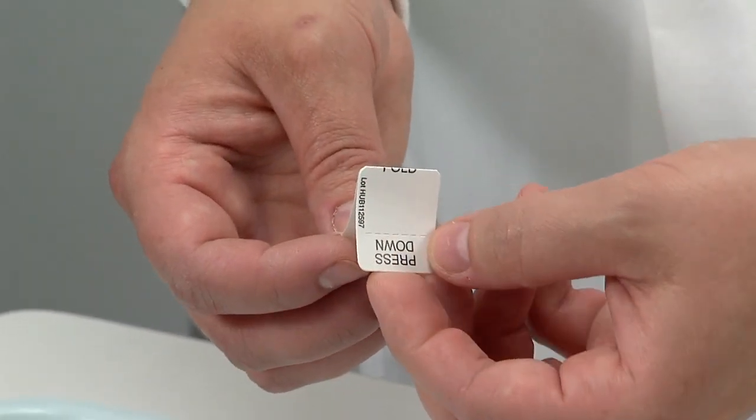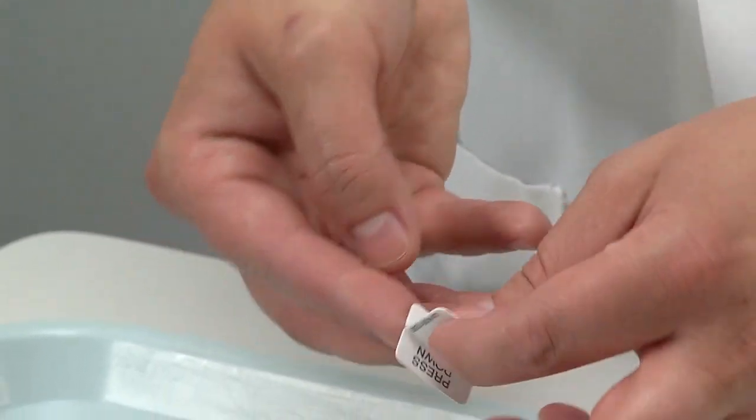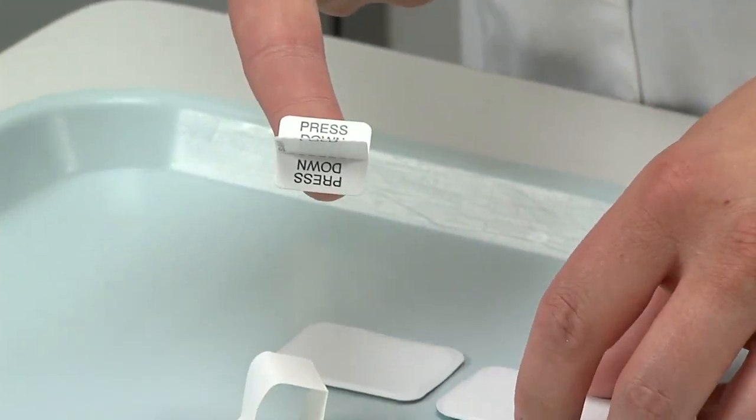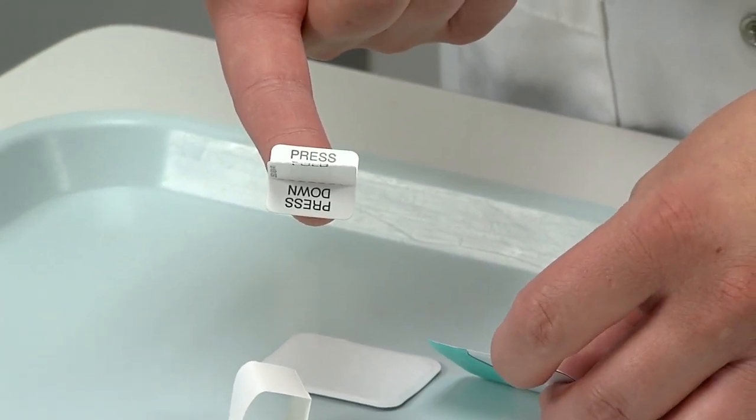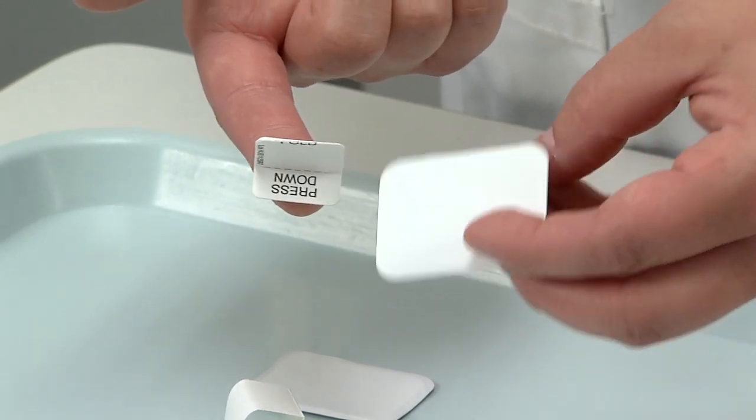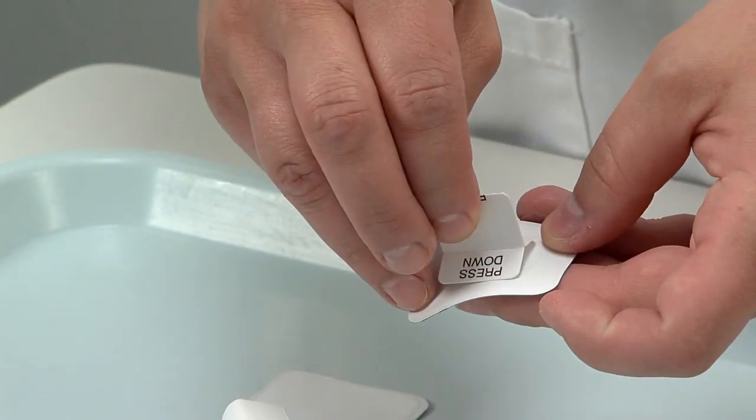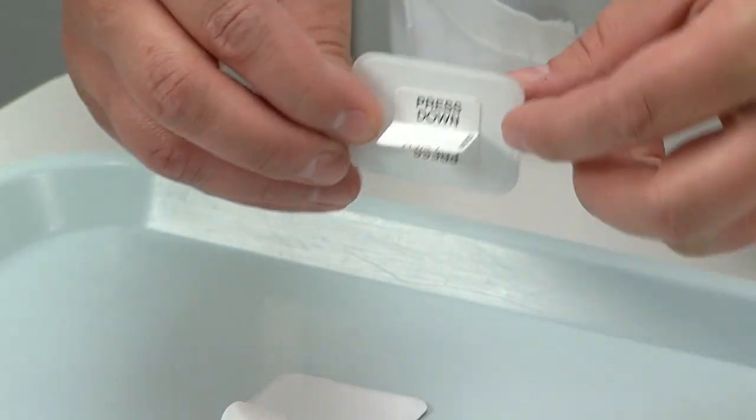The two little wings on the side where it says press down are going to come out like so. Then this tab is going to be placed on the center of the front of the film. Once again, it's important to identify the front from the back, and we're going to stick that right here on the middle of the film.